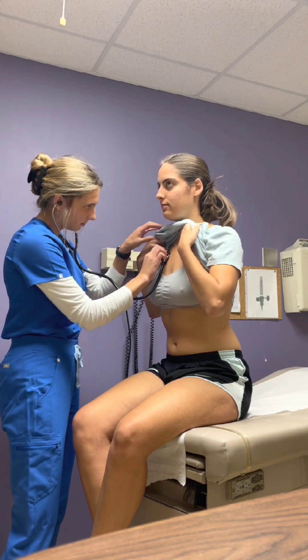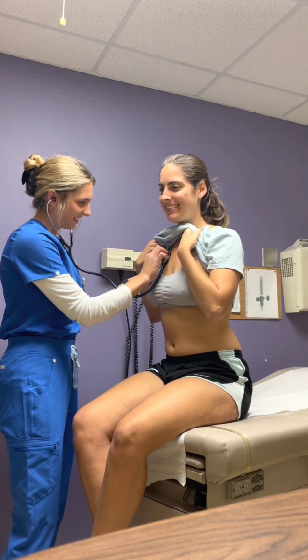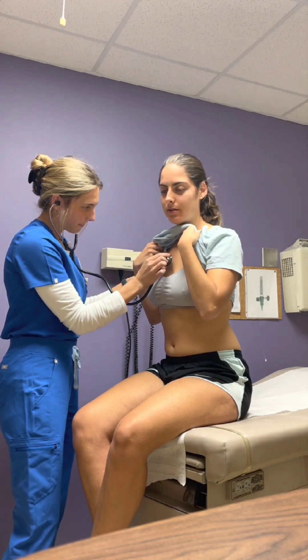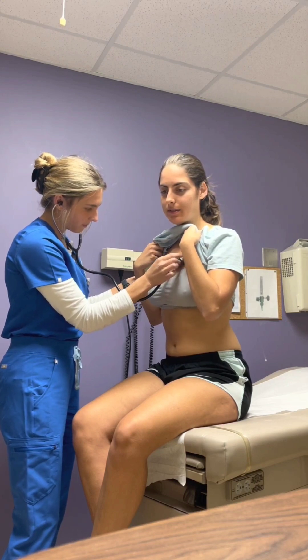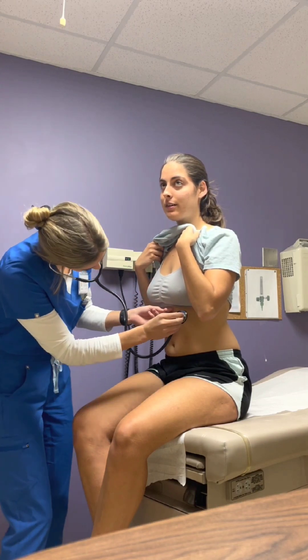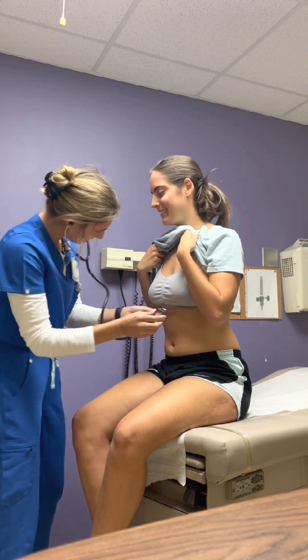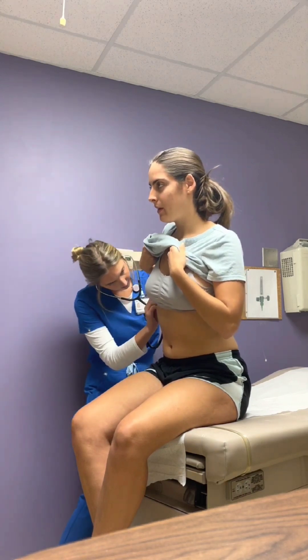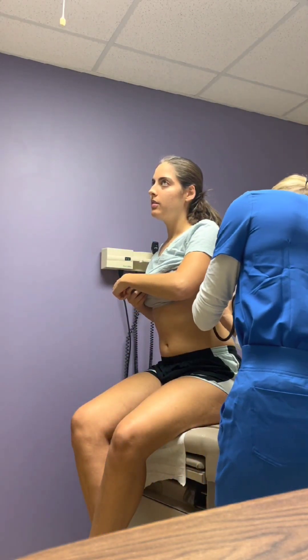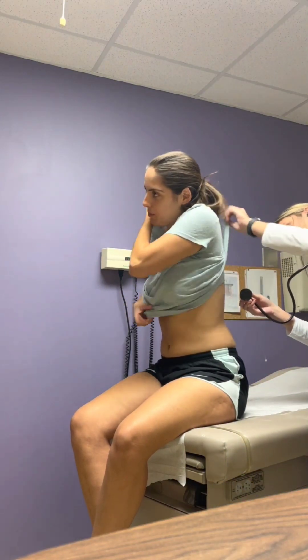I'm going to start up here actually. In through your mouth and out through your mouth. There you go. A little bit down here. One more time for me. Perfect. I'm going to move to your side here. I'm going to move to your posterior — you can kind of pull my shirt open.